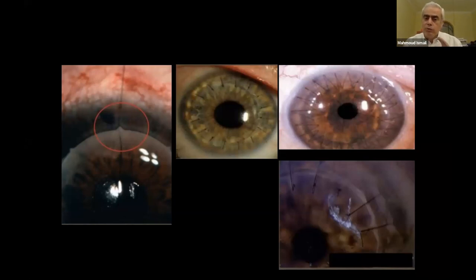Now, we go to the suturing signs that you can see on the slit lamp postoperatively. Actually, you should see them intraoperatively. There is a small trick you can do. Either grab the keratoscope to see if the surgery is even, or use a small bubble in the anterior chamber after closing the pupil, after constricting the pupil using miotics. This air bubble will help you assure whether it is oval or almost round, so you can judge your graft traction.